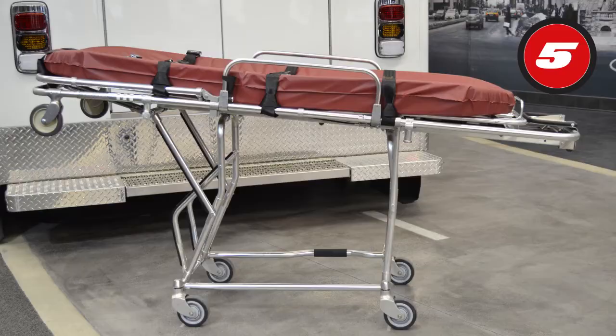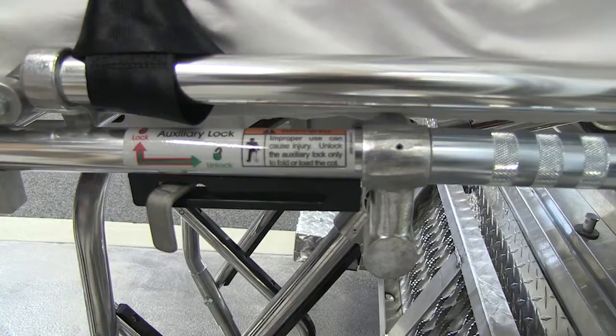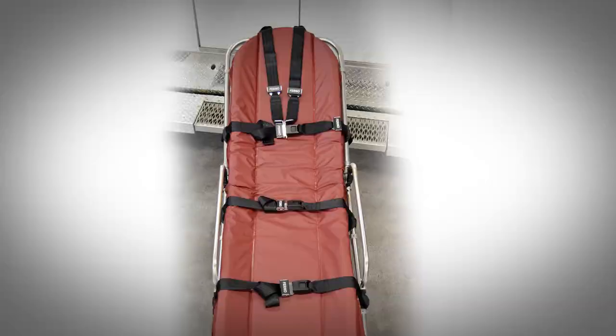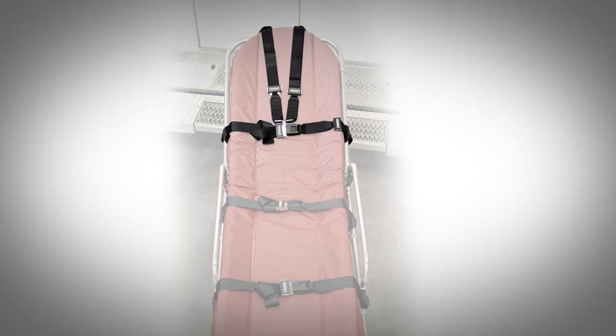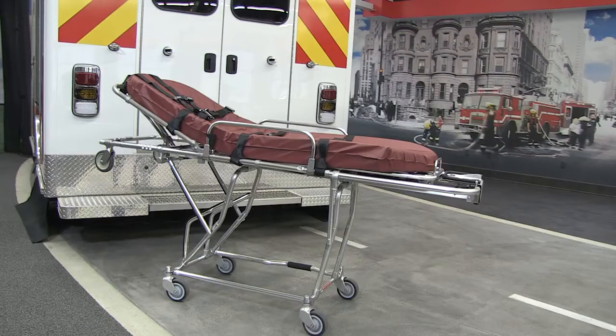The wheels swivel in all directions. The 93ES Squad Mate adjusts to five positions for patient transfer. The auxiliary lock must be unlocked to fold or load the cot. Accessories shown here are two Model 430 and one Model 417 restraints. For a complete listing of additional accessories, visit www.ferno.com. This ends the orientation section of this presentation.